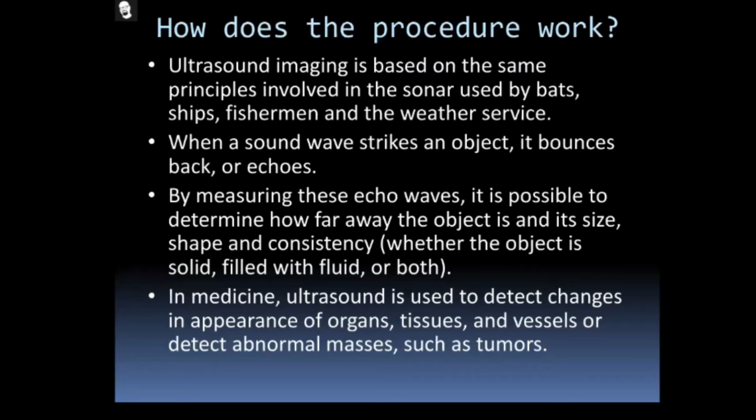Then, coming to how the ultrasound procedure works. Ultrasound imaging is based on the same principle involved in the sonar that we already saw. When a sound wave strikes an object, it bounces back or echoes. Once the sound wave moves into the internal organ, wherever it meets any of the tissues, that sound wave will strike the object and return.